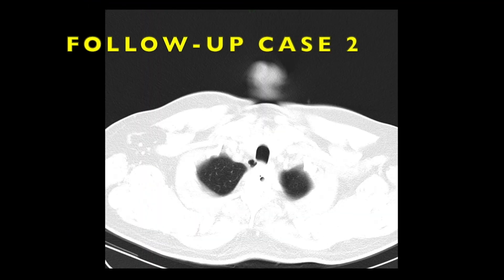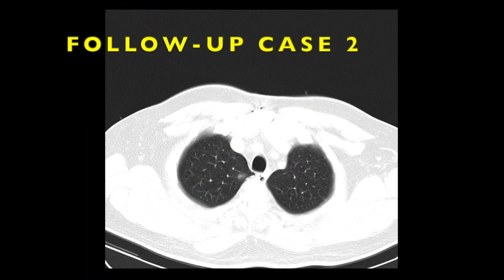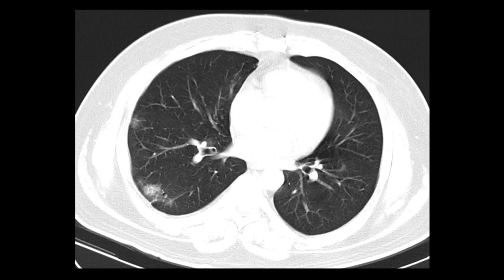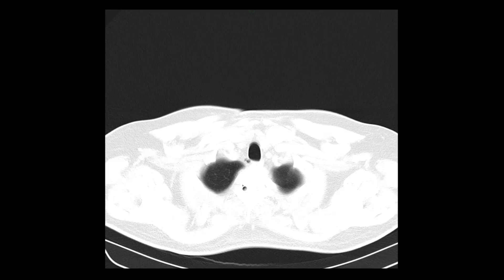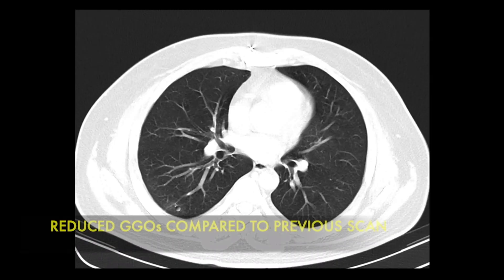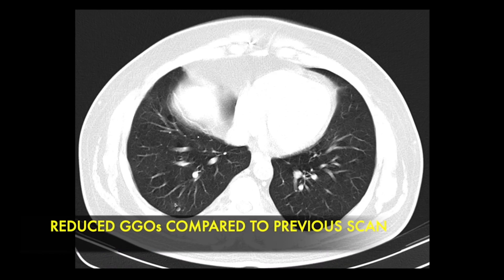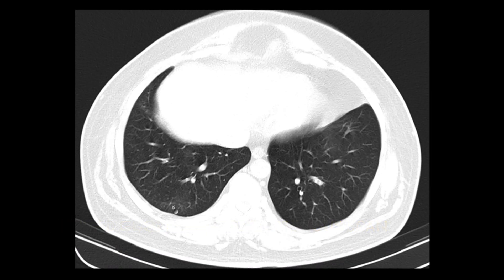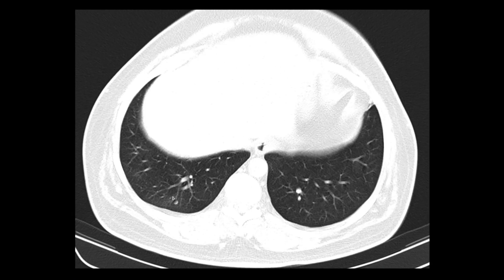This is another RT-PCR proven case of COVID-19 showing multiple ground glass opacities in the right lung. A follow-up CT after 8 days showed reduced ground glass opacities in the same region, demonstrating the response to treatment and recovery.